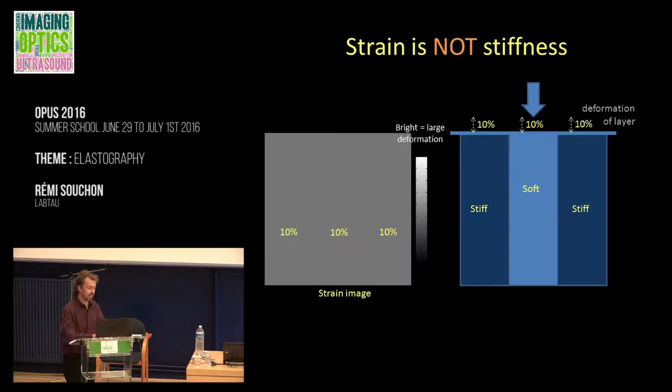What has actually changed here is that the stress has changed within the 3 layers. The 2 stiff pillars act as 2 columns, like in Roman architecture, and they stand all the weight. So there's larger stress in there, whereas the central layer undergoes very little stress.